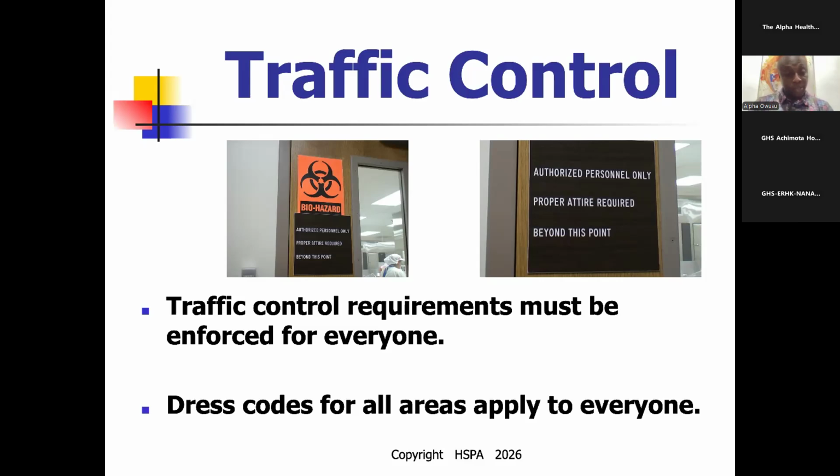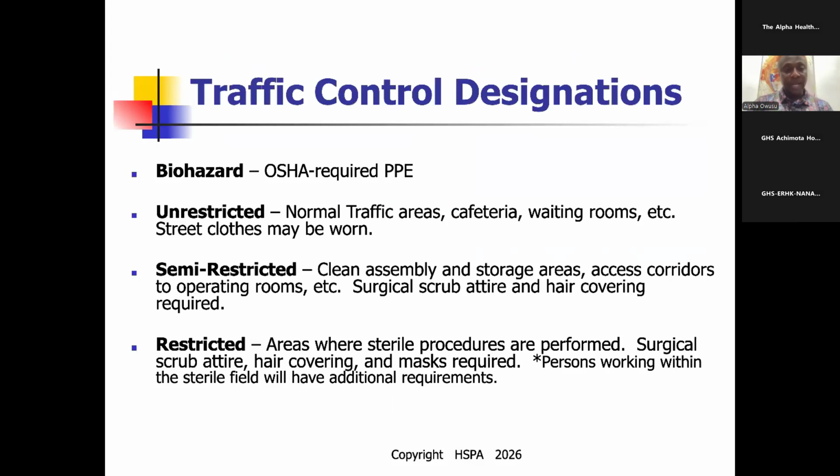And then dress code. Now, biohazard. In the decon area, biohazard should be there, and OSHA requires full PPE.